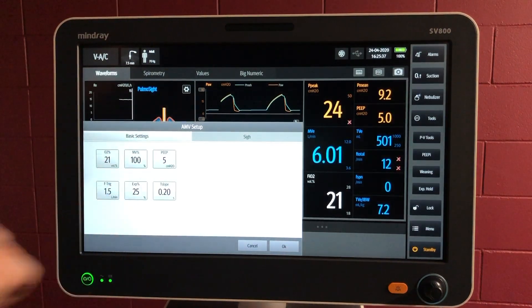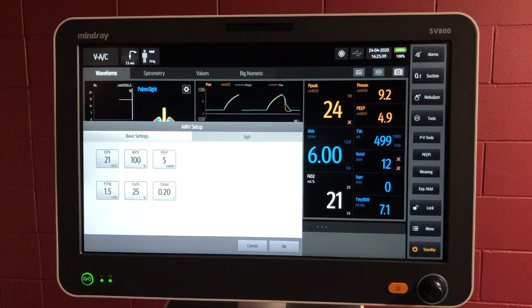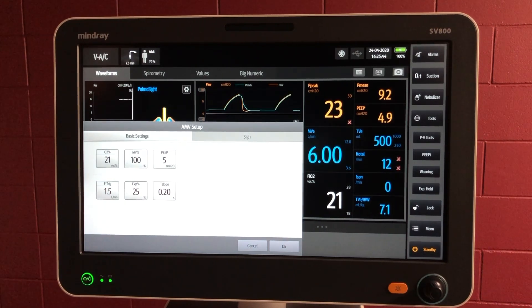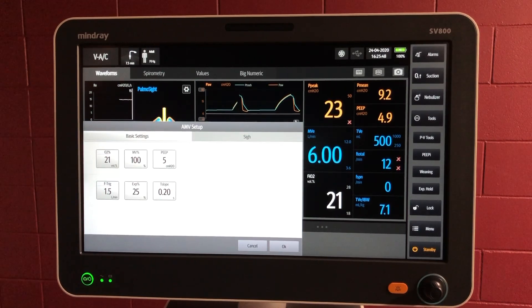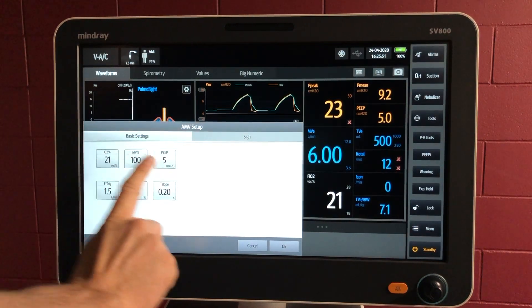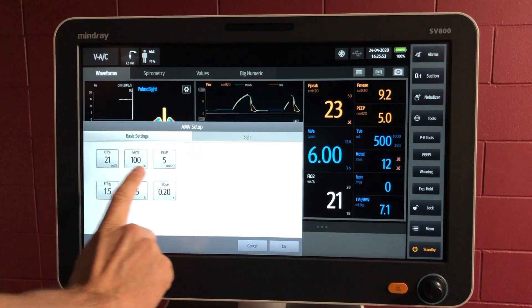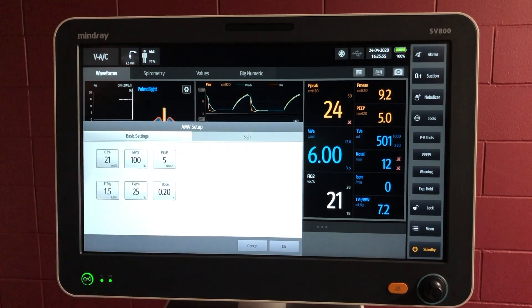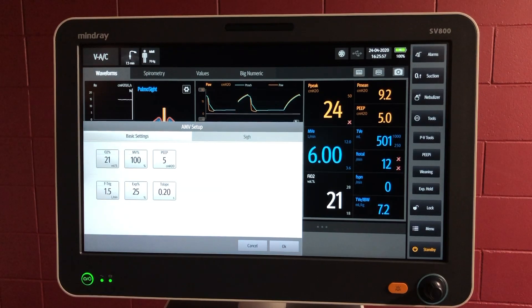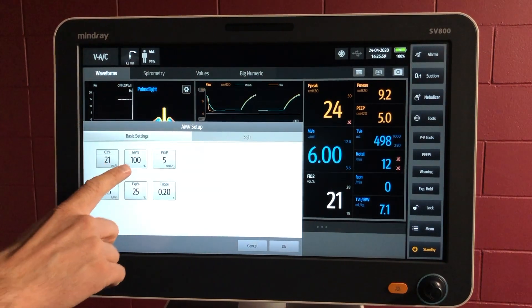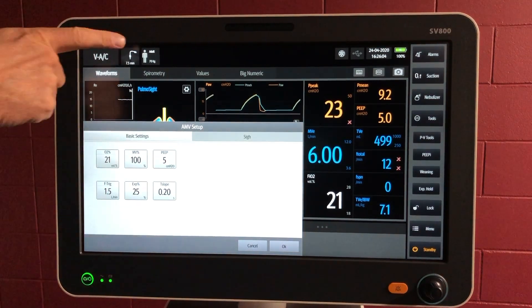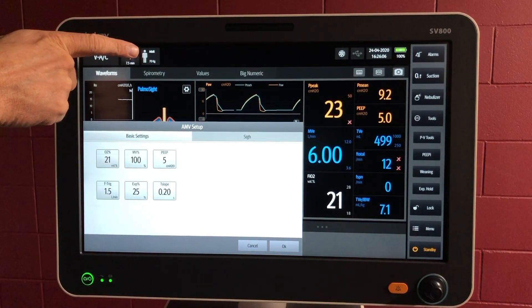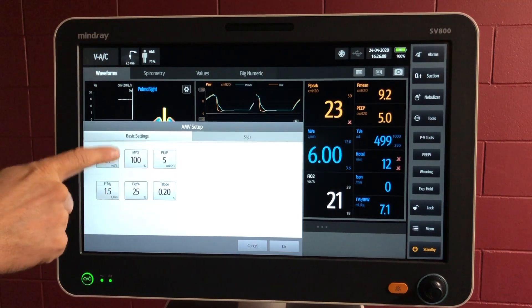These are the basic settings and there's not many of them, and that's part of the automated mode type configuration — you put in minimal data and the ventilator calculates things on your behalf. The oxygen and the PEEP you'll be familiar with. The minute volume percentage you might be less familiar with. The 100% minute volume is essentially the amount of minute volume calculated for an adult male of 70 kilos in this case for normal metabolism.